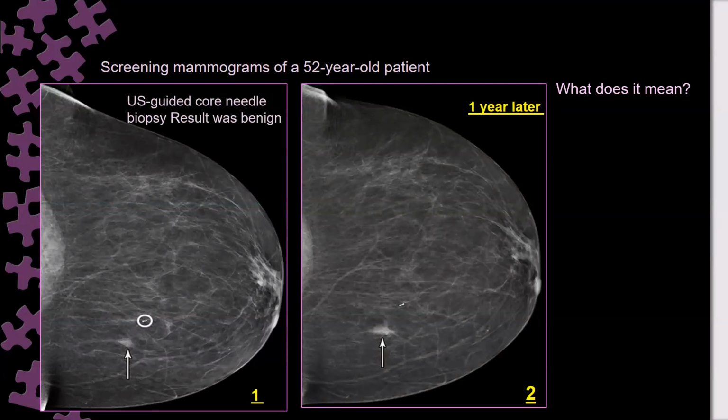The biopsy was in the wrong place. Excellent. So there was mammography ultrasound discordance. They have taken the biopsy on ultrasound from a site different from the site on mammography. That means mammographic ultrasound discordance.